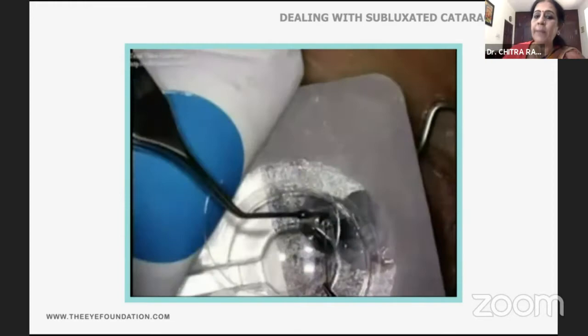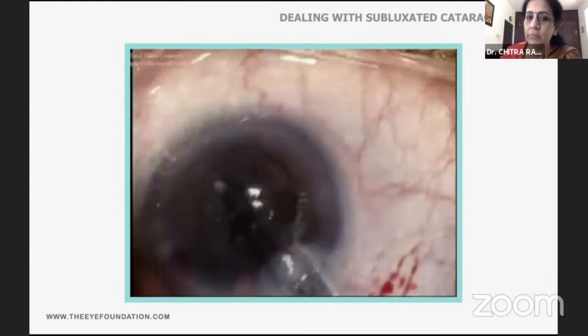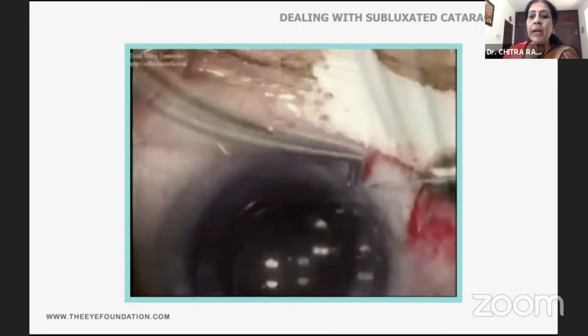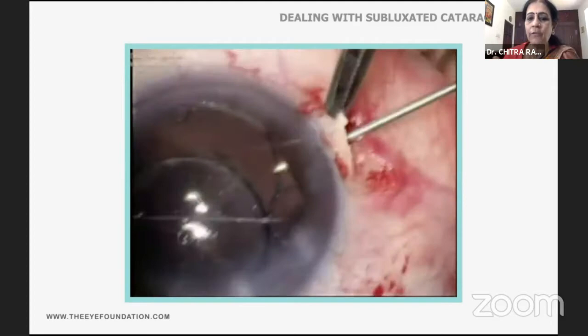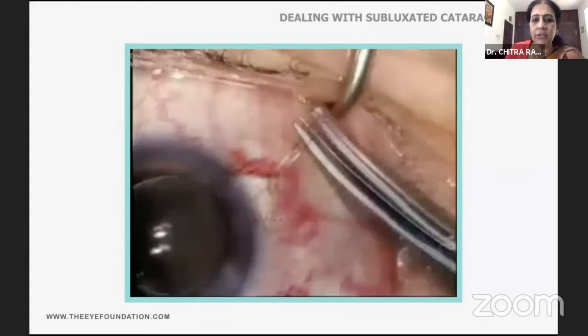And then here a CTS, a threaded capsular tension segment, is being placed. You need to ensure that the eyelet comes to overlie the area of maximum weakness. Remove your capsule hooks after that. Position your intraocular lens into the bag. And then you could do a Hoffman's pocket. At that time, I had created a scleral triangular flap. And then you go on to your routine railroading technique and suture the capsular bag to the scleral wall, remove the viscoelastic, close the flap, and the surgery is complete.